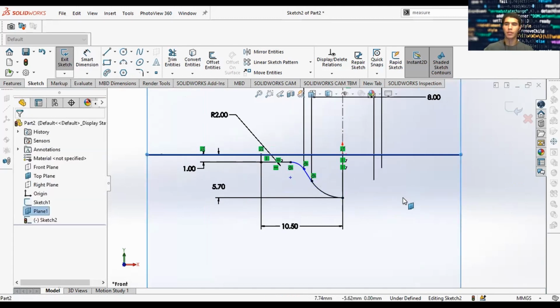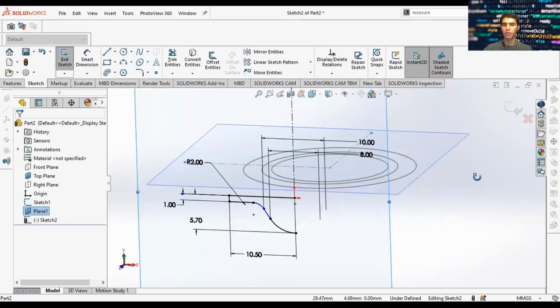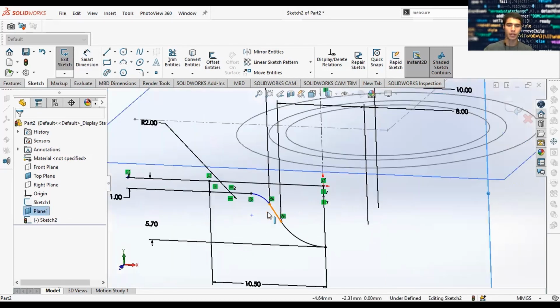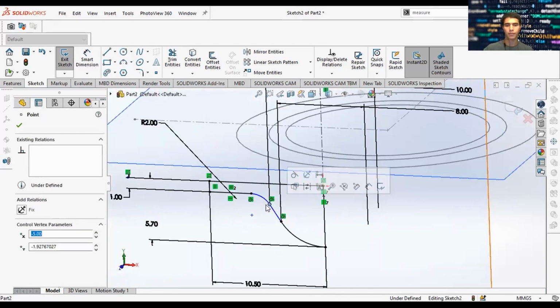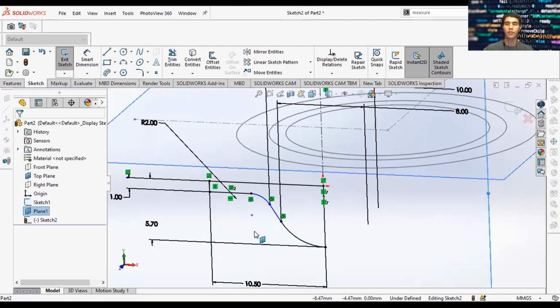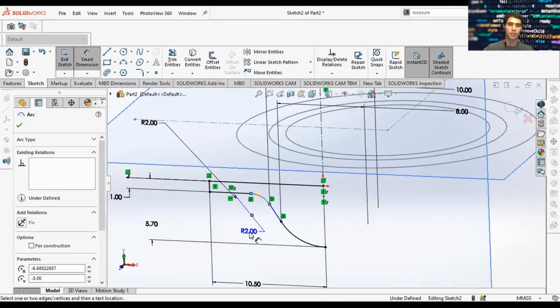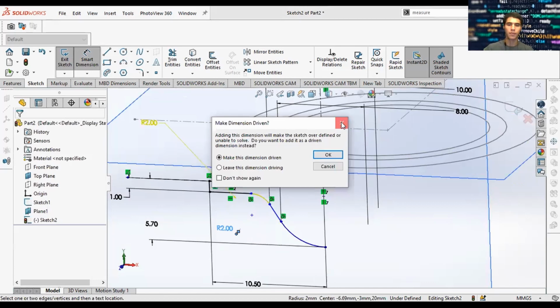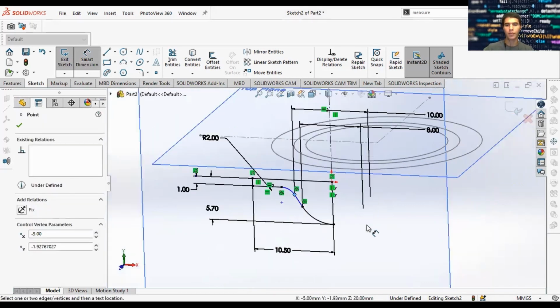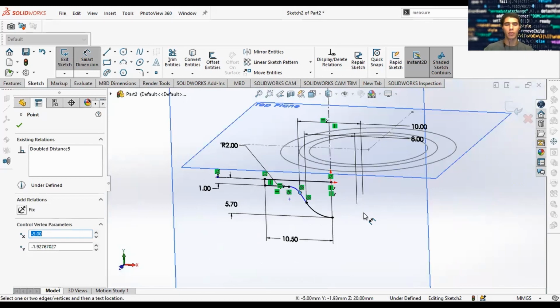And so by the end of it, you'll notice the sketches go from blue to black. The difference is when the sketch is blue, it's underdefined. So if I can click and drag this spot in the sketch, I can pretty much move anything I want in this sketch. It's just telling me if there's something missing in this sketch that would fully define it. And it's probably this radius here. So let me go ahead and add a dimension to this. All right, that's not the radius. But once you have a fully defined sketch, it will turn all black.